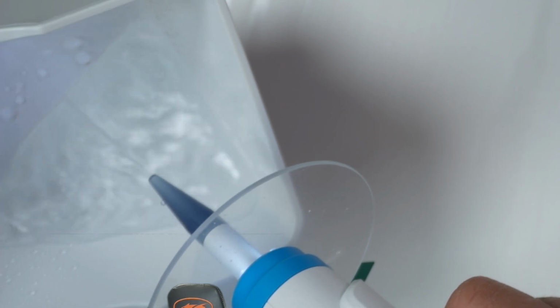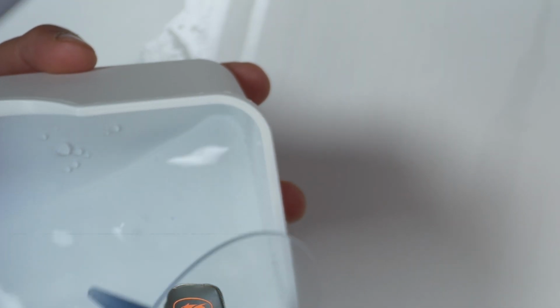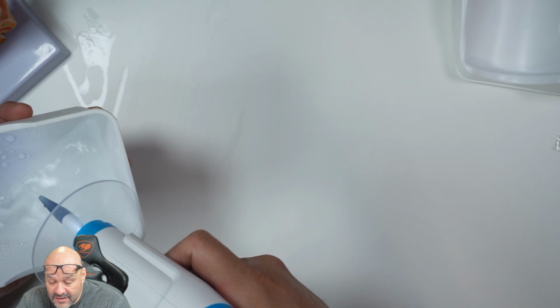This is kind of like the last one. So push the button, and that's pretty much all the water. Look at that much water I did real quick. And go back to 1, all right? So very slow on the last one.